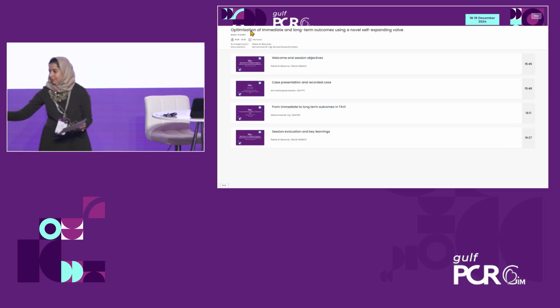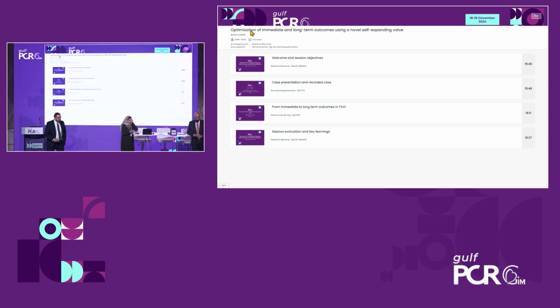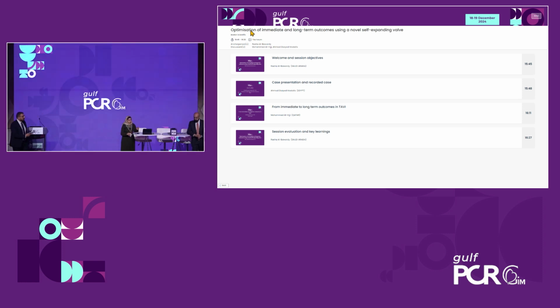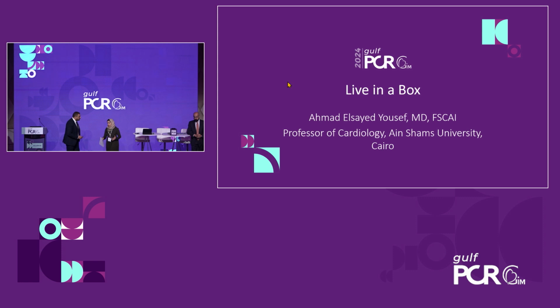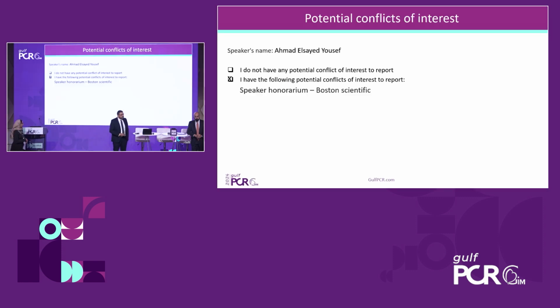Okay. Thanks, Rasha. It's my pleasure to moderate this session together with Rasha and Mohammed, and hopefully we'll stick to the learning objectives of this session. Let's go with the case.